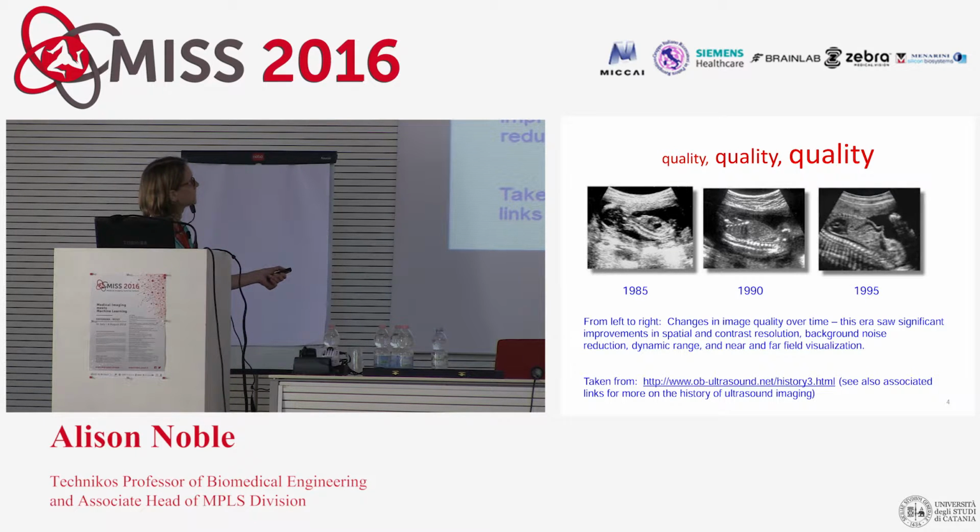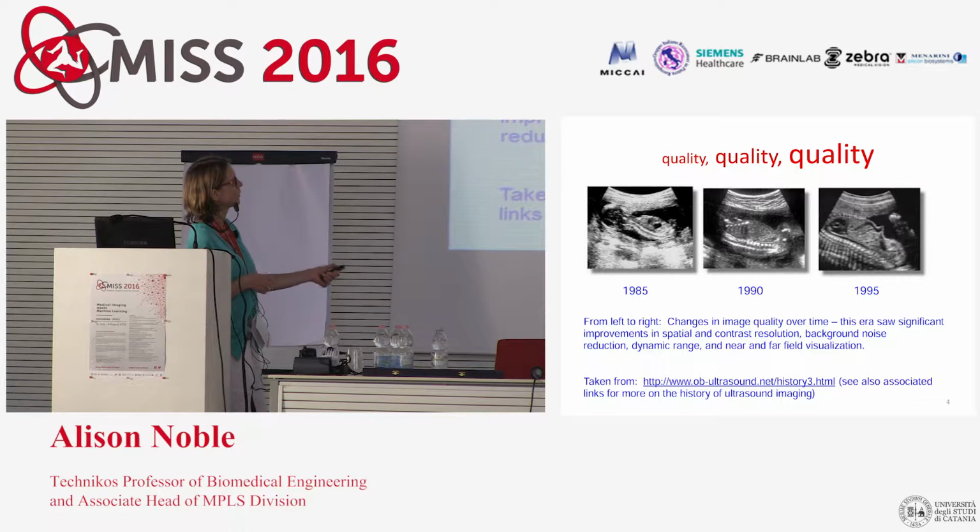Here, the spine is coming down here, and what you're seeing here that looks a little bit odd unless you know what it is, this is shadows. The probe is at the top, and these are shadows caused, as you would in natural images, by a shadowing effect, where all the ultrasound has been reflected back off those structures.